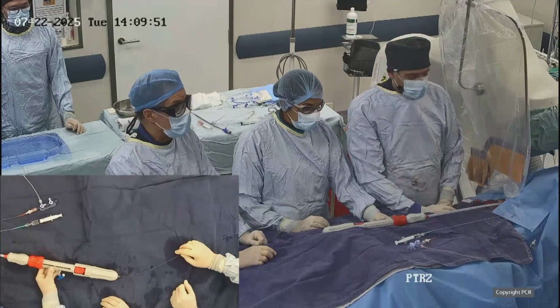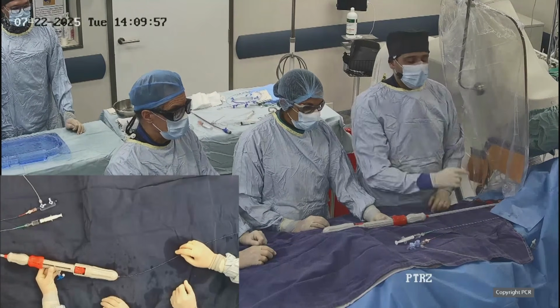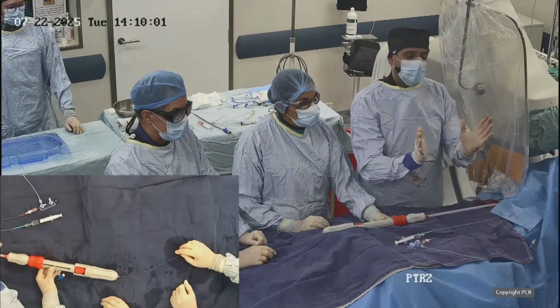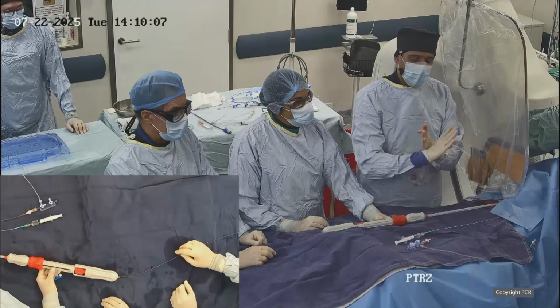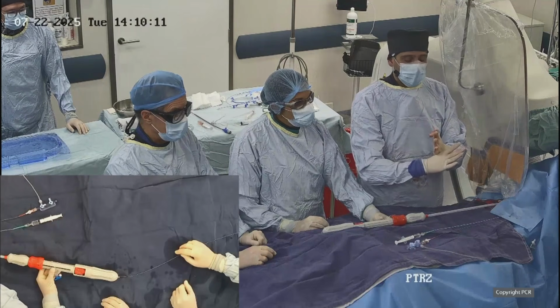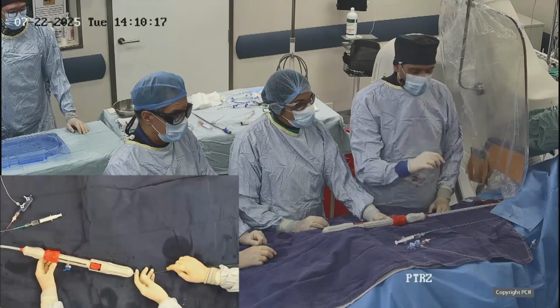The second part is the position of the skirt, like a P shape in the right atrium, and trying to measure the distance between the roof of the right atrium and the system. When we are happy with that, we start deploying and checking.